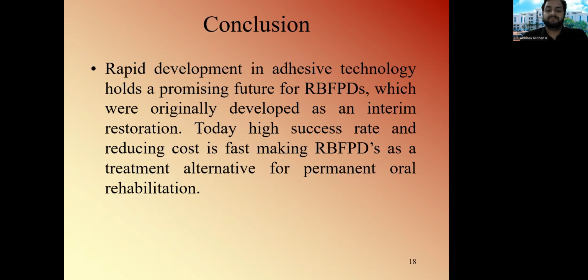So as I said, because of the advanced generation of bonding agents and the technology of bonding, the newer materials in the market, more aesthetic ceramics with better strength available in the market for resin bonded prostheses, and also with the help of chairside CAD/CAM designing machines like CEREC, it is possible to design a prosthesis in a single appointment and deliver it to the patient, which is one of the most important highlights of this type of restoration.